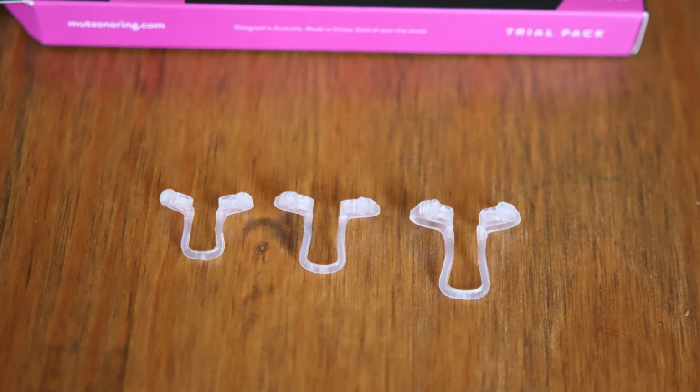It may be because I've customized it and pushed the lateral walls as much as I could. There is still that little bit of pressure on the septum, which at the moment isn't causing me much harm. It's not irritating me too much. But I know some patients later on have a little bit of an abrasion inside their nose. It can cause nosebleeds. I wouldn't try these sorts of dilators if you tend to get nosebleeds. But the airway from this Mute device, I think, works the best for me.